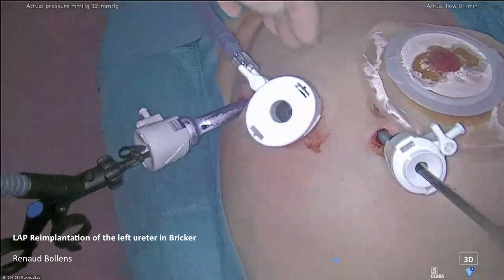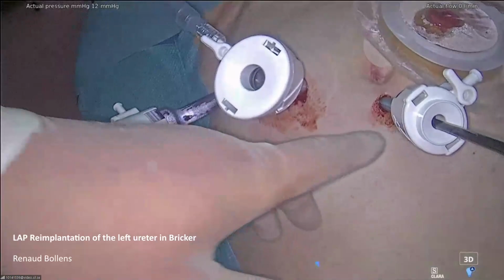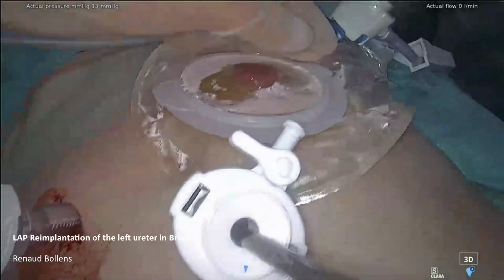Then the umbilicus is at the level of my right hand, because like that we displace all the ports to the left flank of the patient. I put my camera more or less at mid distance between the umbilicus and the anterior iliac crest. I was lucky because I didn't hit the epigastric vessels, which can of course be an accident when you are at this level. And this one is close to my epigastric vessels. On the other side of the camera port, I had a 5 millimeter trocar for my assistant.